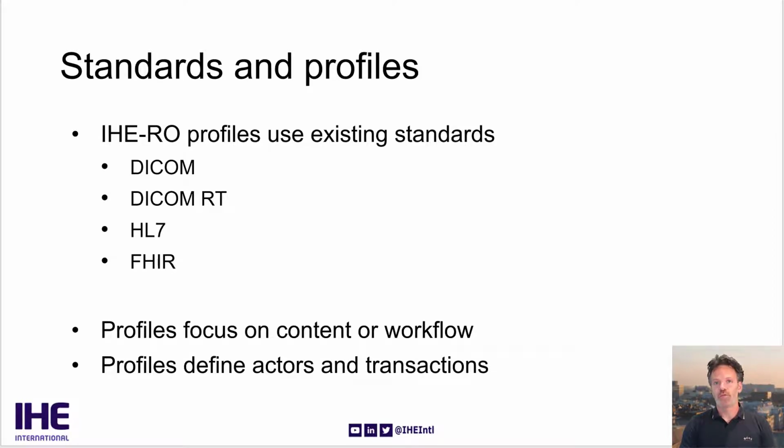So what's this about profiles, and aren't there standards? Yes, there's a bunch of standards, and IHE-RO uses those. The most commonly used standards are DICOM, which is a standard for exchanging imaging information. There's an extension of DICOM called DICOM-RT, and that includes treatment plans for radiation therapy. There's also HL7 and FHIR, which are standards for generic healthcare-related communication.